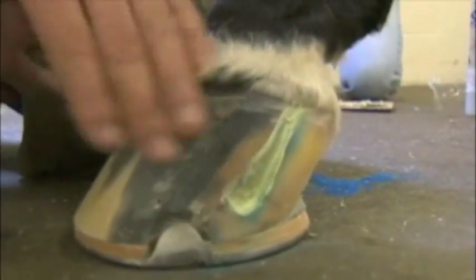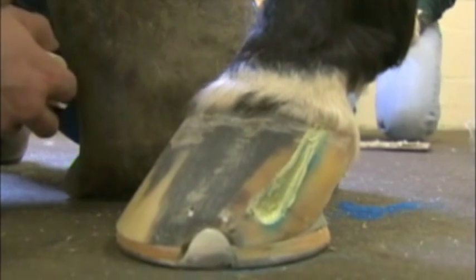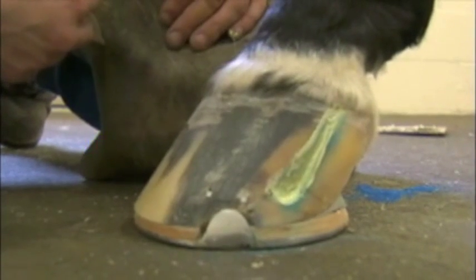It's important. You don't want to put glue directly against the bed of the crack because it's a perfect environment for bacteria to grow. A little bit of moisture accumulates under the bed of the crack and they get an abscess under the Equilox patch. You can also pack it off with cotton — it's an absorbent layer that will also prevent abscessing.